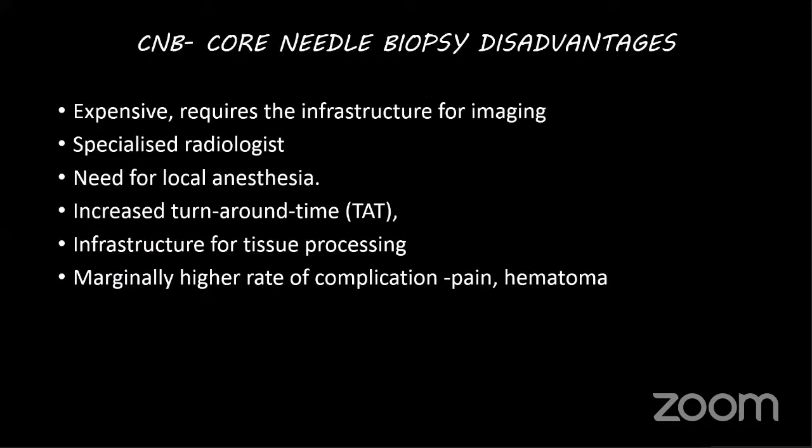Now, the core needle has certain minimal disadvantages. Yes, it is slightly more invasive than FNA, but really does not make a difference. Pain and hematoma can be there, but usually if you perform it with a good technique, it is not there. The turnaround time is, yes, slightly more in core needle biopsies. In FNA, we get the result the next day only, and in biopsies, it may take at least 3 to 4 days for processing of the tissue.